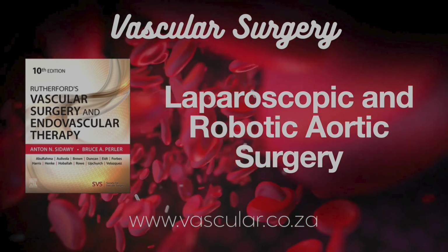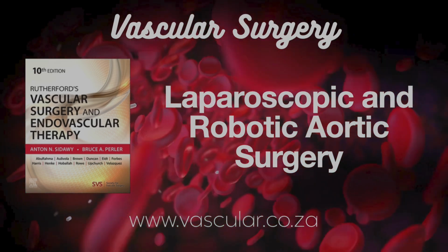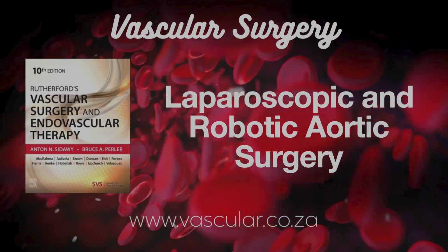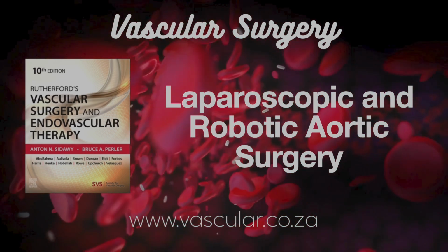Okay. What about robotic conversion rates and limitations? Conversion rates reported are, again, variable. Maybe 3% for occlusive disease up to maybe 13% for aneurysms. Reasons include technical robot issues or bleeding, like from those lumbar arteries again. So still not zero risk of conversion.